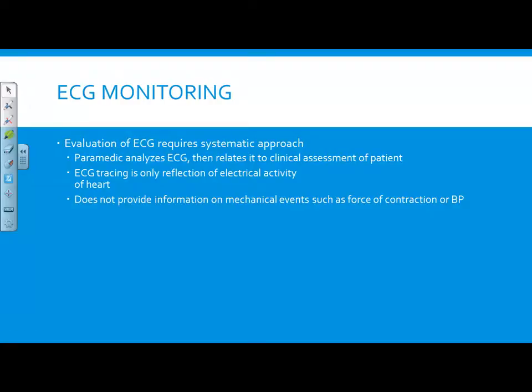When you evaluate an ECG, you're going to have to use a systematic approach. Everything that we do is going to be a systematic approach, all the way down to your assessments and anything else. Think about it. You form a system to memorize things. You form a system to interpret things. You do it the same way each time so that it gets easier and easier and easier. Once I start teaching you the 5 steps of rhythm interpretation, you will use those 5 steps for every rhythm that you interpret. All right?